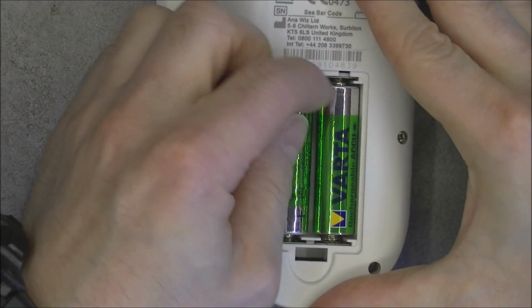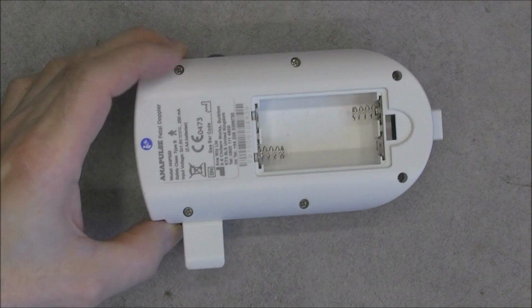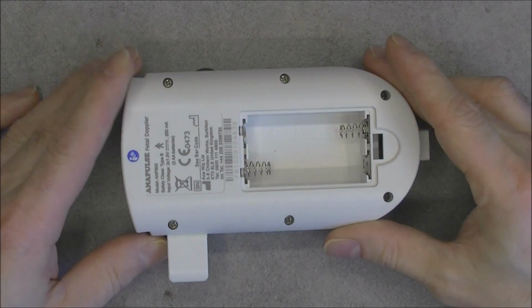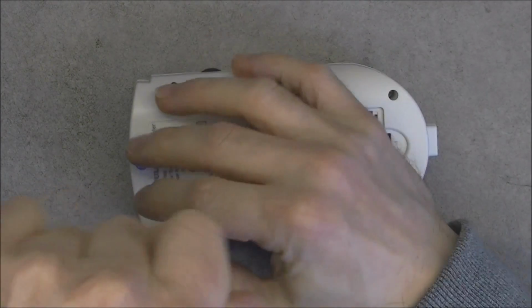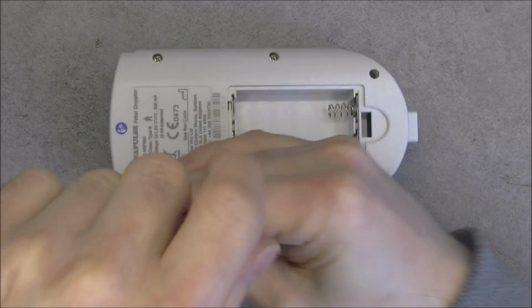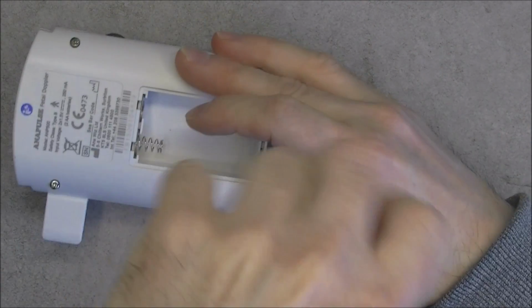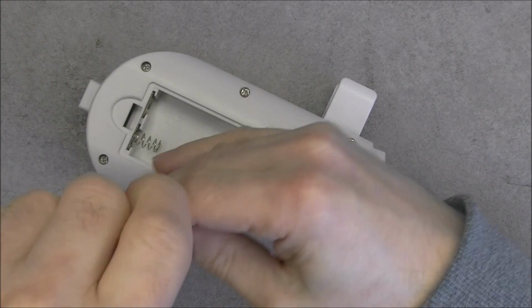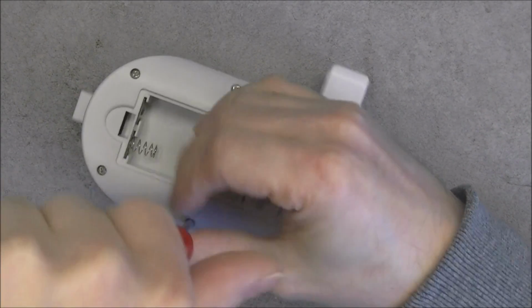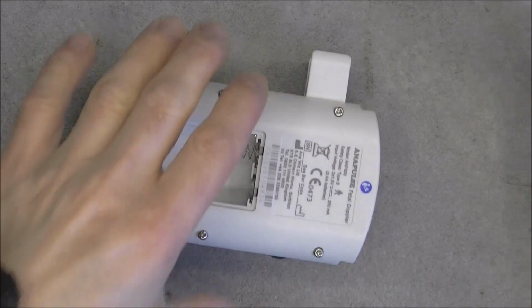So I will first undo the batteries. Then I will start with opening this device. It will be pretty quick, and then I will try to open the probe, which will probably be more difficult because it is completely sealed, or at least welded. But here we just have 6 very cheap self-tapping screws, and this box is really light, so I believe there is not much inside. In fact, I already checked, so I already know what there is inside, but you will discover.